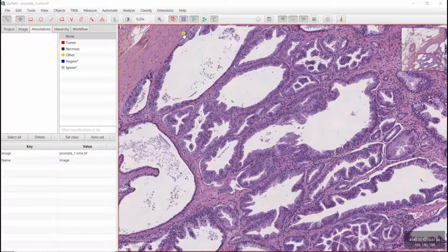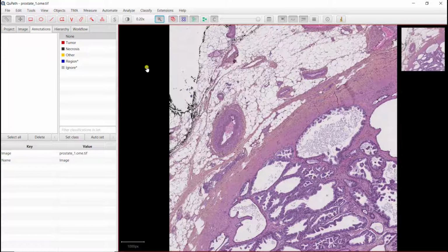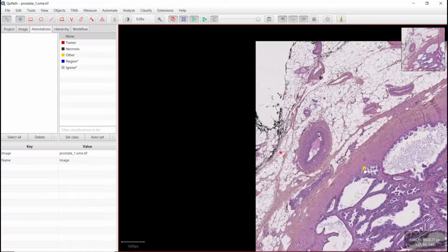Something I didn't show you before, you can use this small icon to look at your entire image. That can be convenient. Just one thing, when this is on, and you can see here it's surrounded in blue, you cannot do anything. Here I'm trying to zoom in, zoom out, move. Nothing is working just because this is on. You see the entire image, and there's nothing you can do to change that. It's not always surrounded in blue, but we see that it's a little bit shaded in gray. If I unclick it, now I can zoom in.